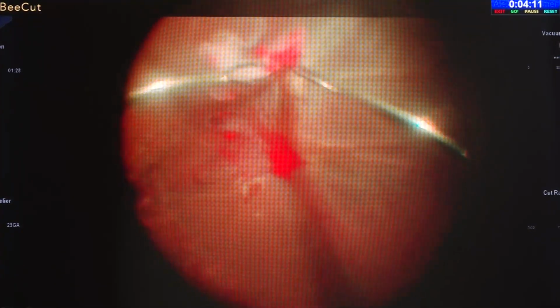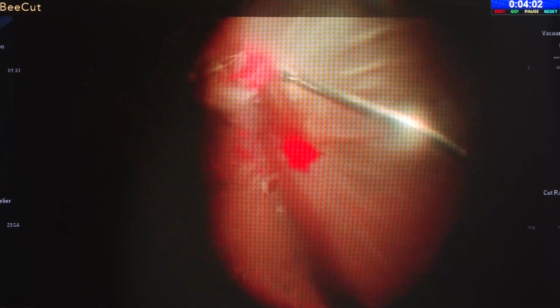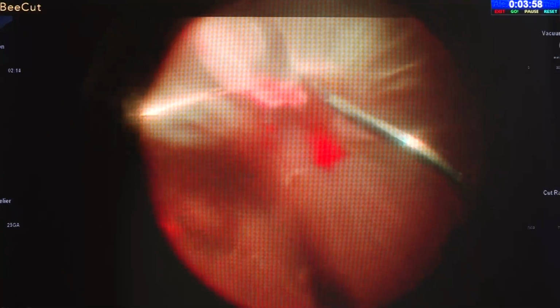So also do not remove this SRF prematurely, because this SRF which is there is actually thick and viscous, and it's giving support to your retina and does not allow the retina to get lifted when you are doing the dissection. But if you drain the SRF prematurely, then the retina becomes even more mobile, because the infusion fluid which seeps inside makes the retina more mobile, and that creates more difficulty in your surgery.